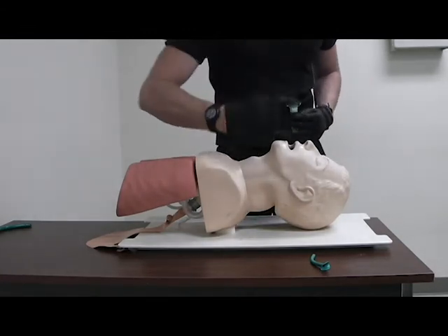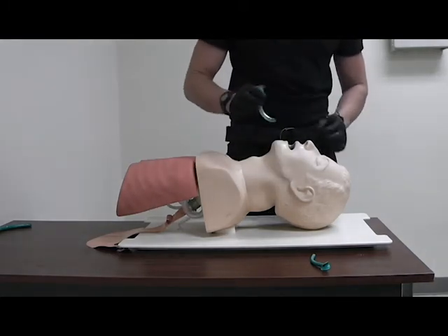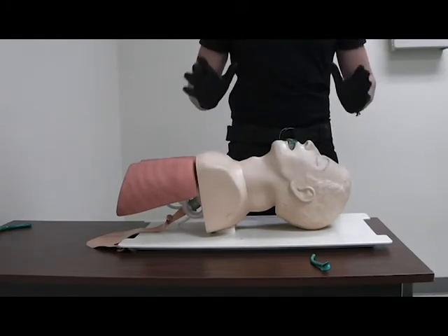Take an appropriately sized OPA, measured from the corner of the mouth to the lobe of the ear. Insert it 180 degrees opposite, and then as you insert it the rest of the way, rotate it into position. That airway is now supported.